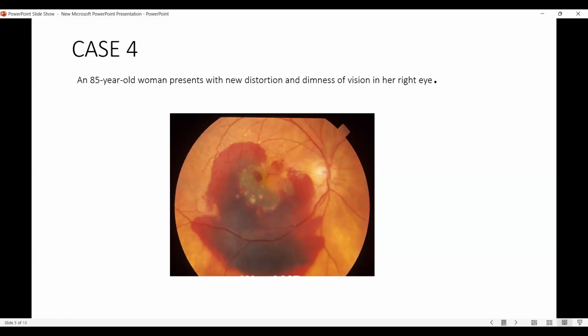Acoustic hollowness. Yes, acoustic hollowness is very important. Choroidal excavation. Yes, choroidal excavation. Orbital shadowing. Basically, there is angle kappa: the anterior surface of the tumor will give high spikes, but the inside of the tumor will give low spikes. It will reduce. So that is very suggestive.